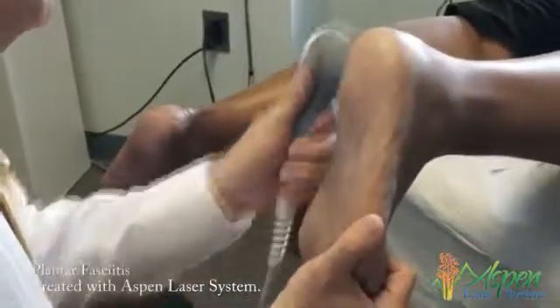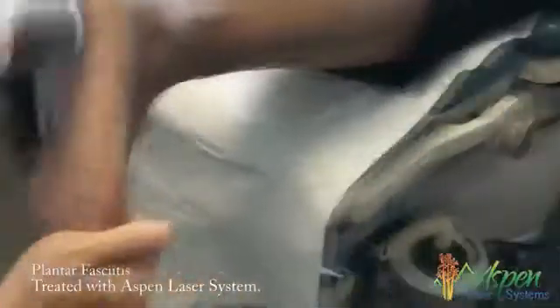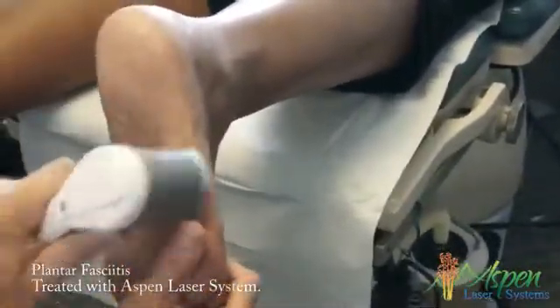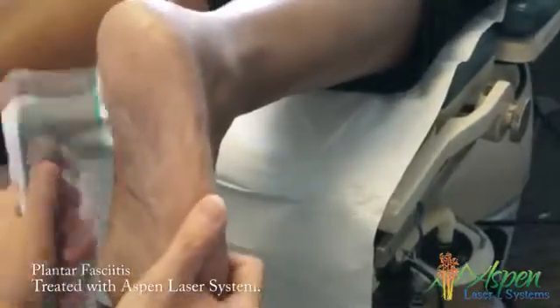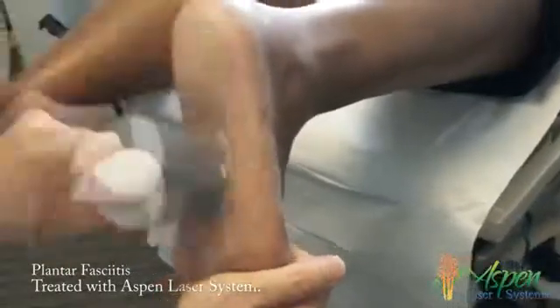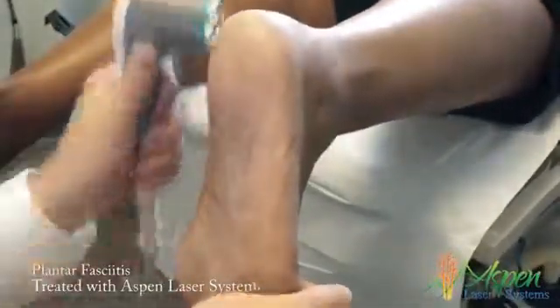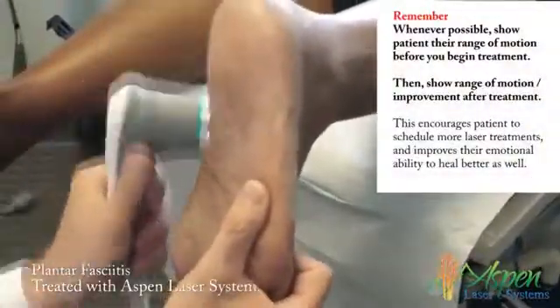I'm pulling your toes back. How bad is your plantar fascia where I'm working — does that hurt a lot down in here? About a five? When you move, is it here, here, or everywhere as far as pain? It's more the heel in the back — we concentrated there before — and a little bit right there where the surgery was.